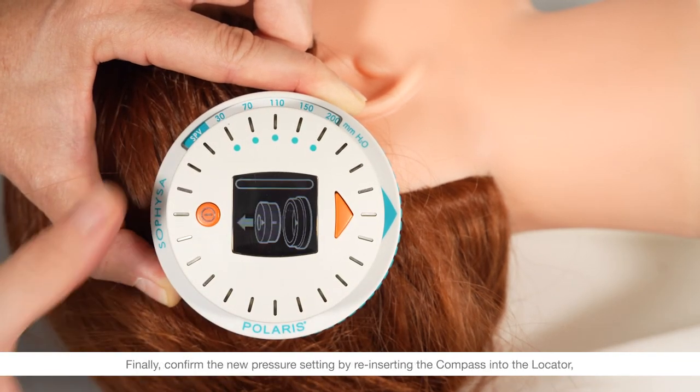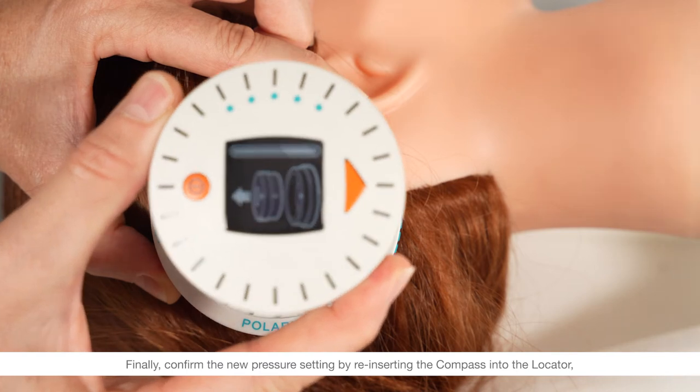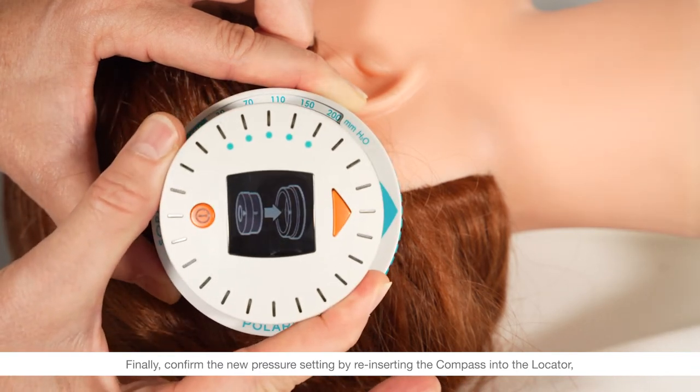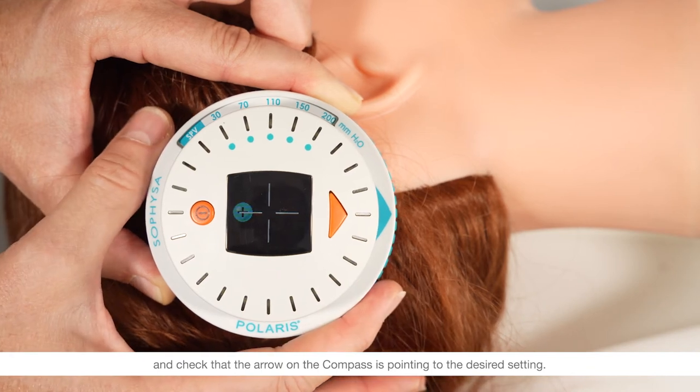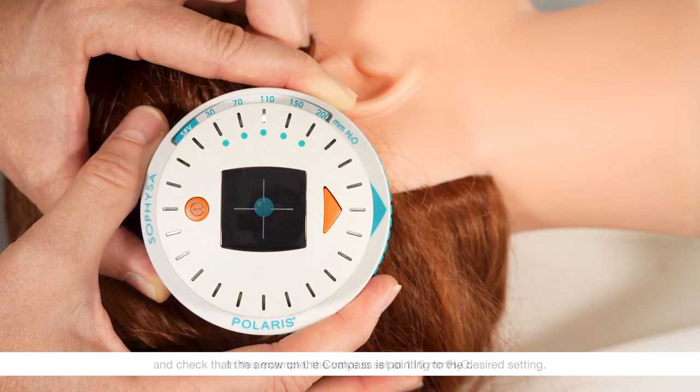Finally, confirm the new pressure setting by reinserting the compass into the locator and check that the arrow on the compass is pointing to the desired setting. In this example, the valve is set at 110 millimeters of water.